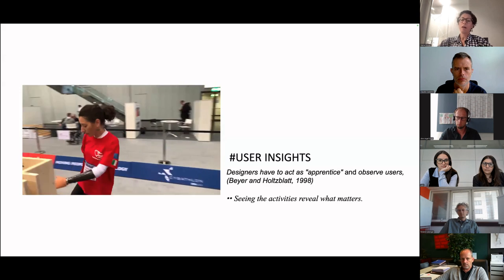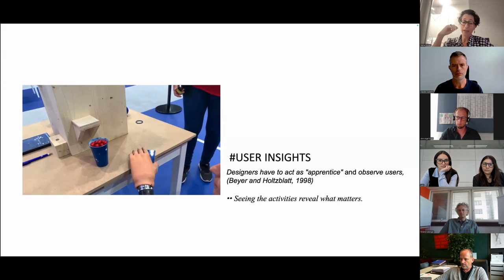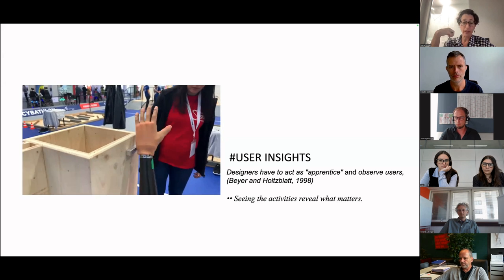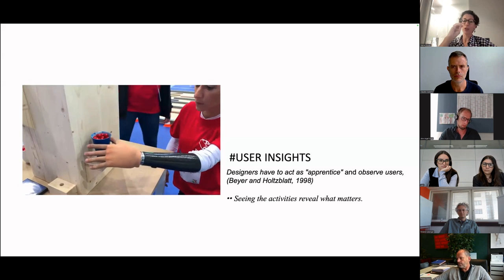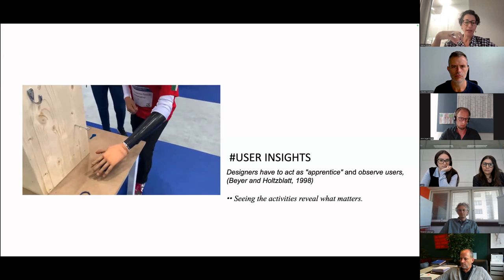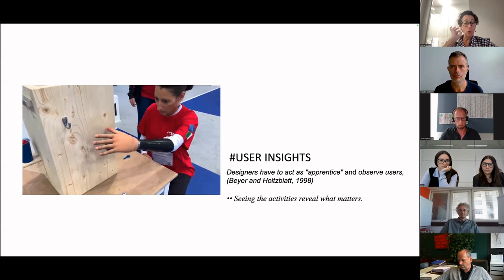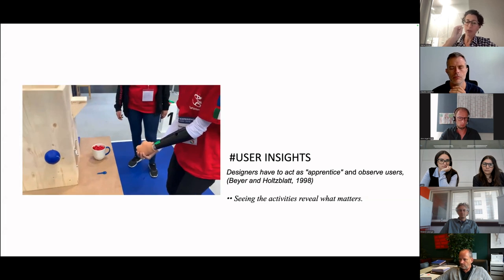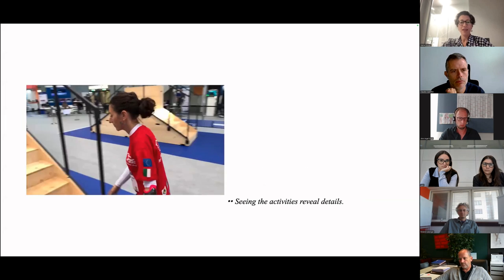Well, and there is also this great paper, which is pretty old now, that pushes designers and our team to act as apprentices in observing and working with users. And this is exactly what the Cybathlon competition pushed us to do, training and trying to solve these daily life activities. We really saw, working with the users, which were the things that really matter in doing daily living tasks.